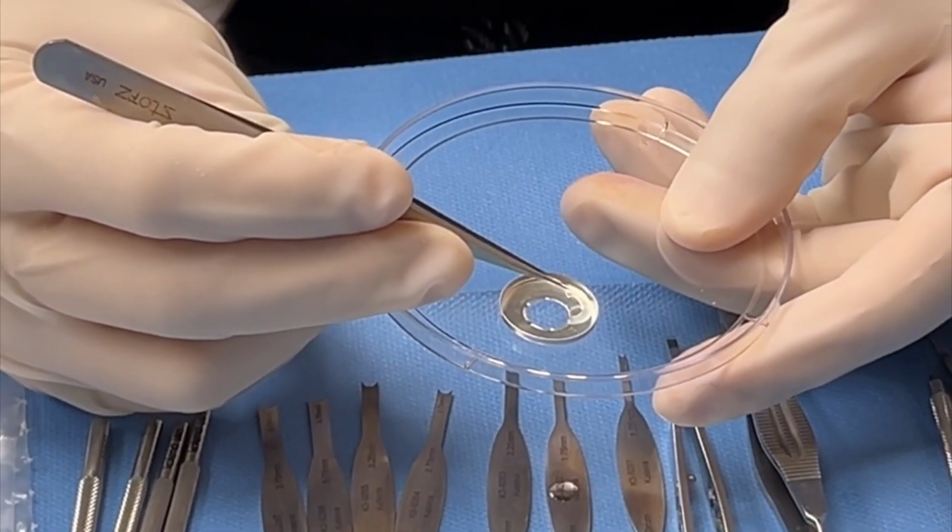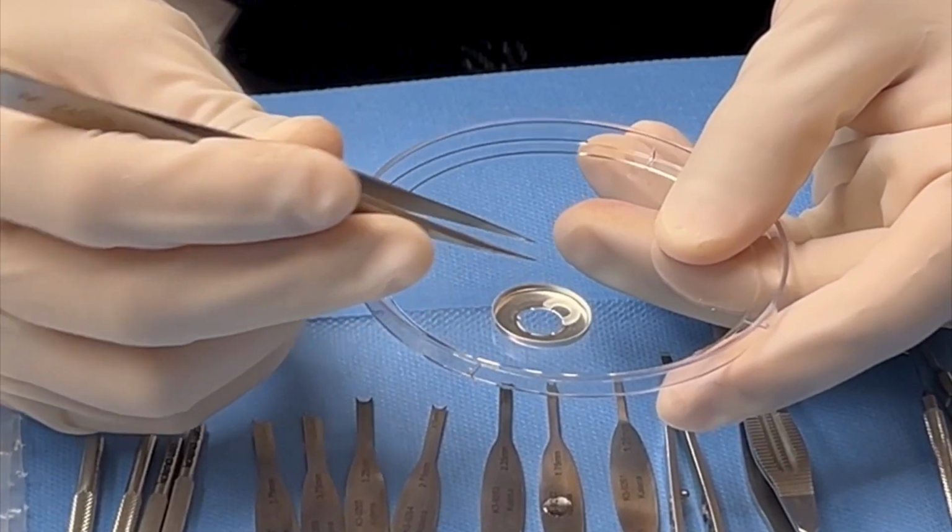Now a question comes up: do we dehydrate it or not? Shadi Awad showed the jerky technique with fresh tissue, dehydrating it so that it's a little bit stiffer to implant. I haven't found it necessary for CTAK tissue. It has enough rigidity because of the gamma irradiation. But if you want to go an extra step, you can let it out to dehydrate.